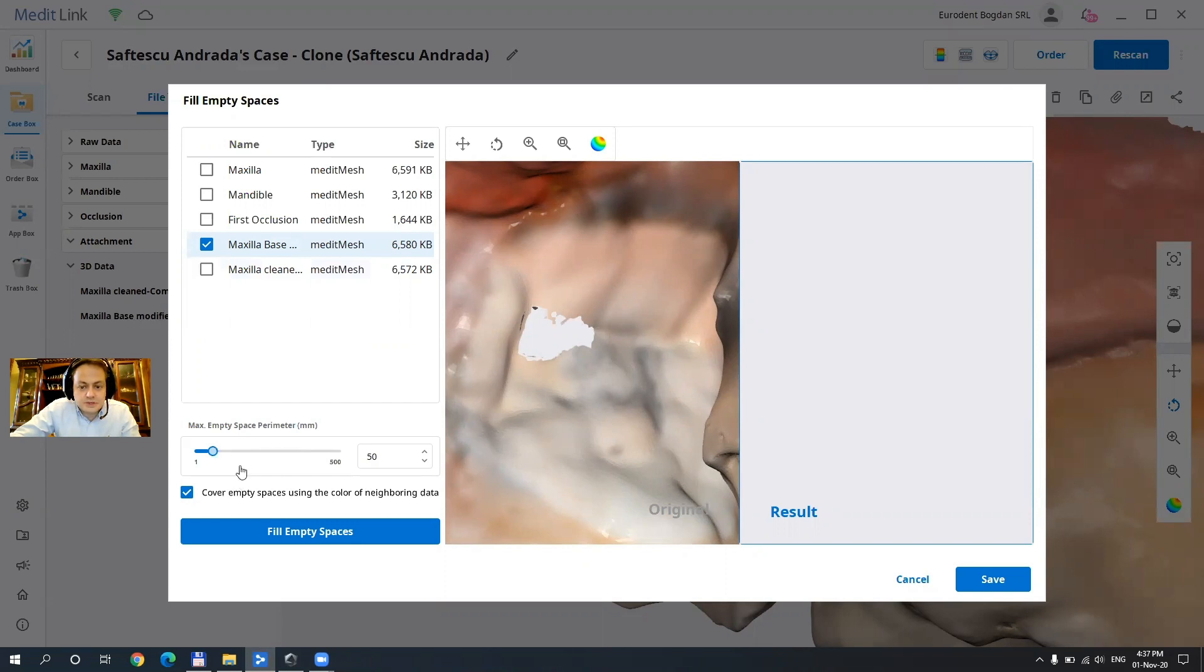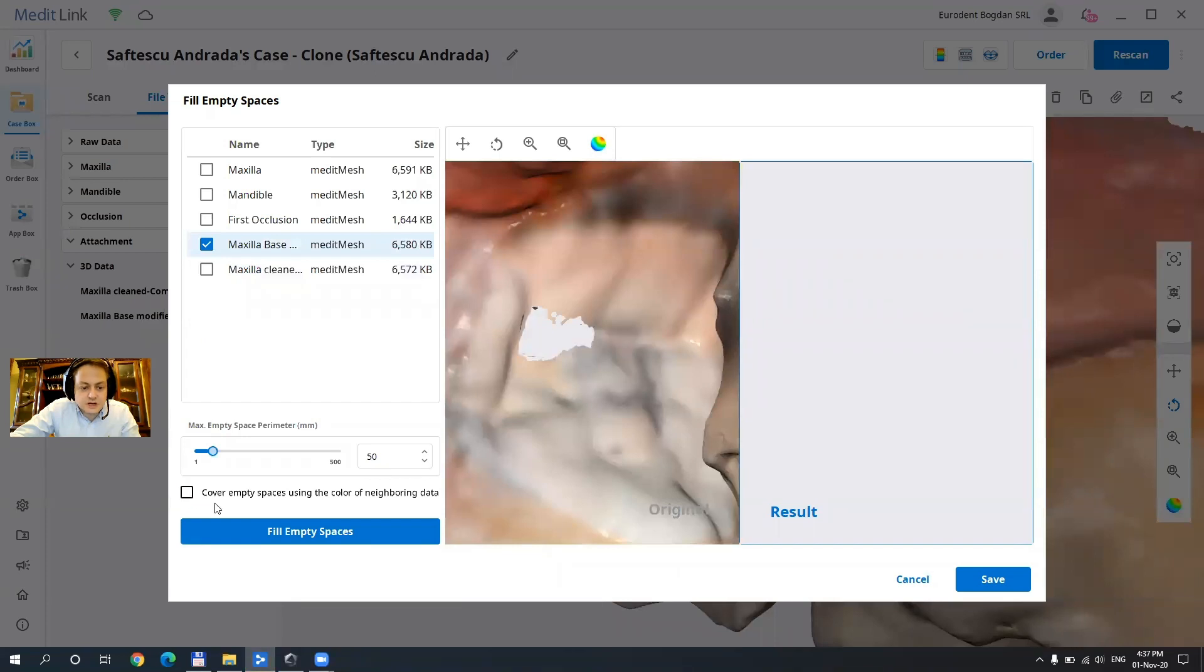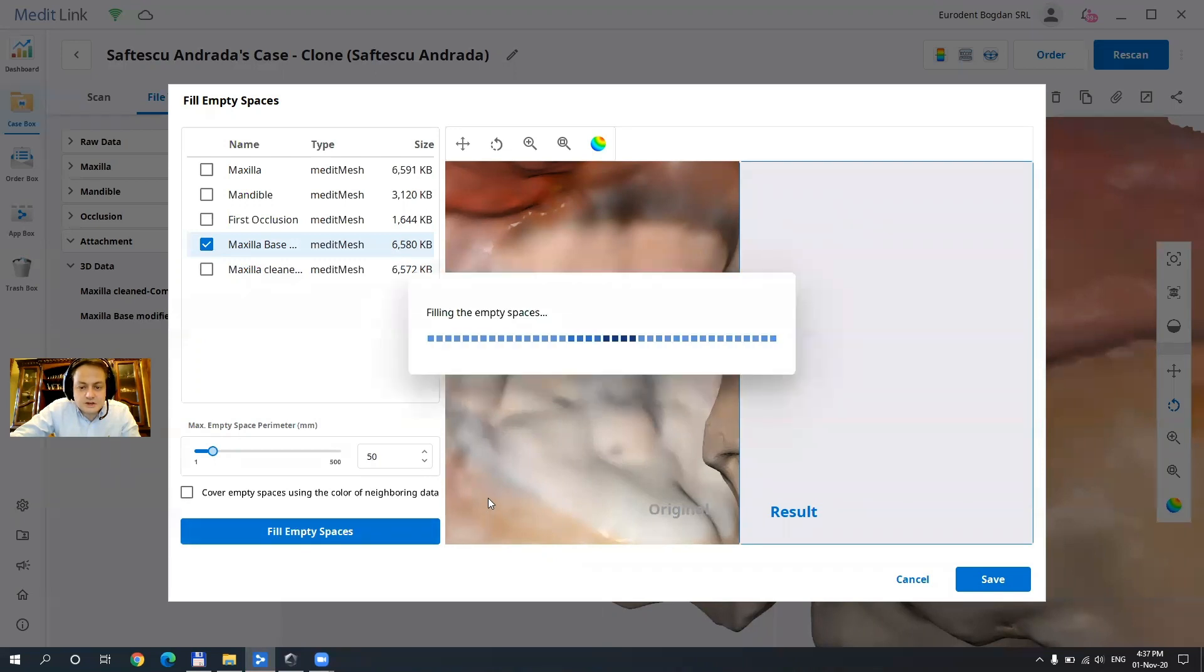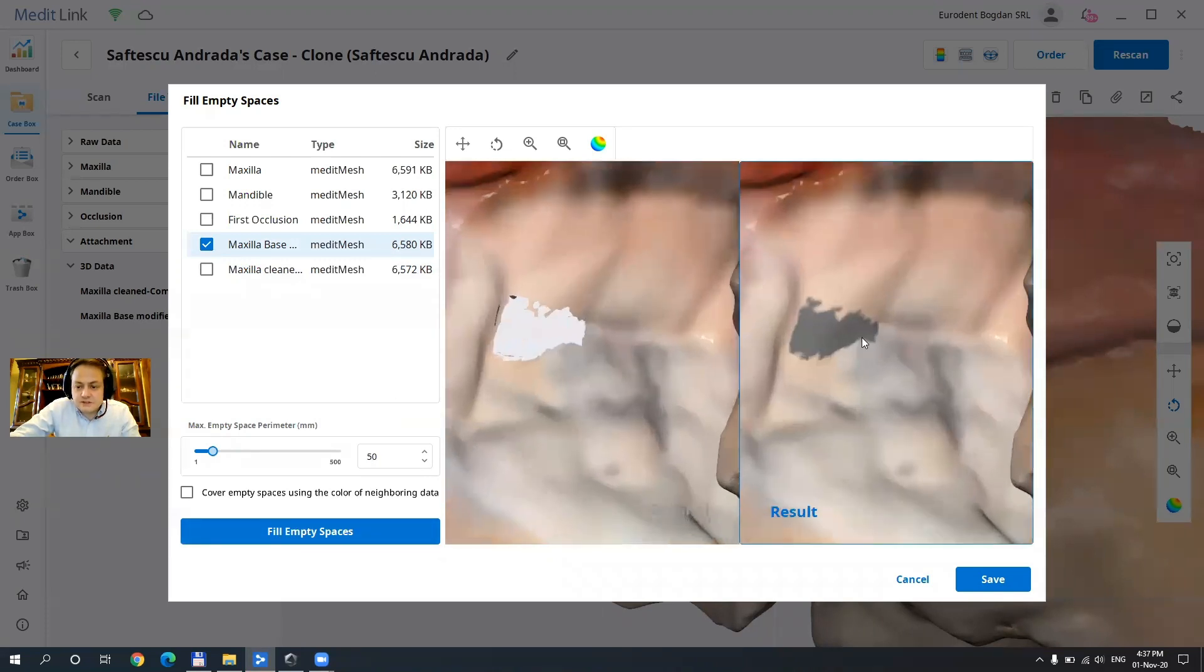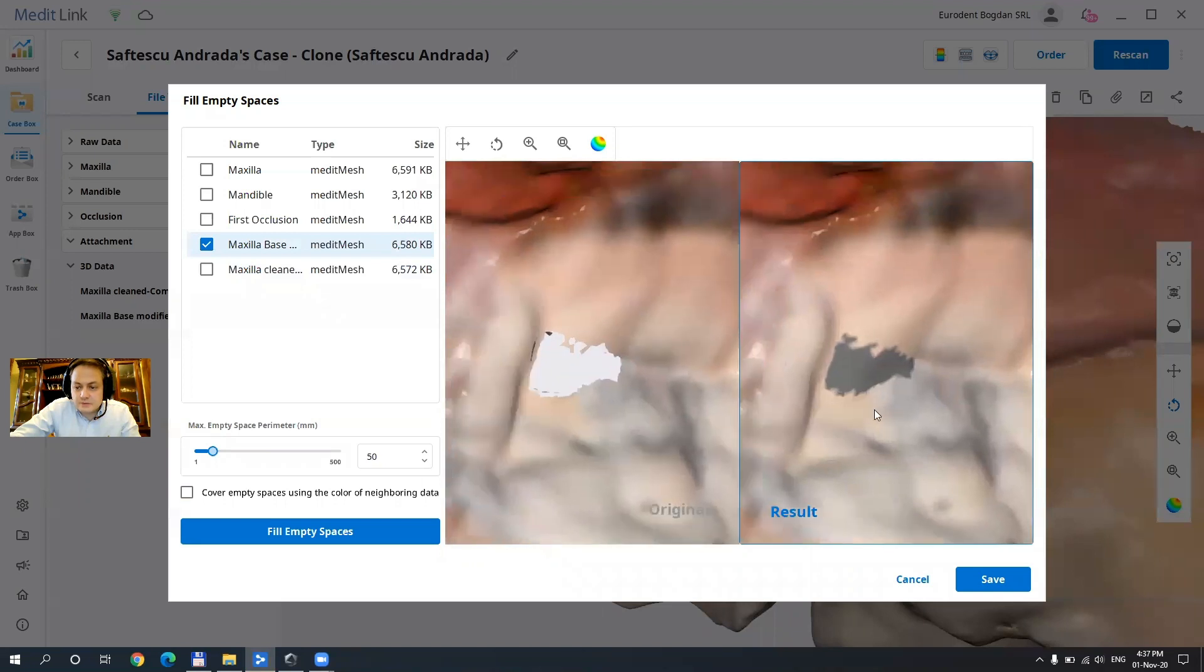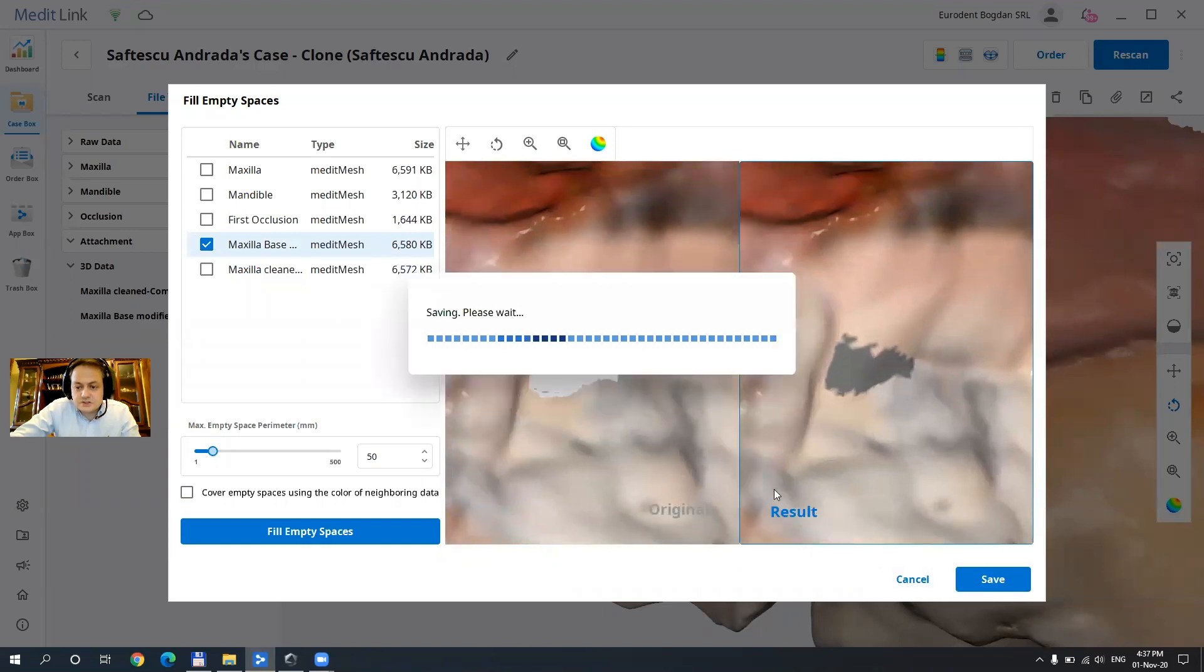And I advise you to not cover empty spaces with color the adjacent or neighboring because you're never gonna know where you did it. So if the final prosthetics is not going to fit, if you uncheck this you're gonna know exactly where it was modified and you can fix it as well. So let's just save it.